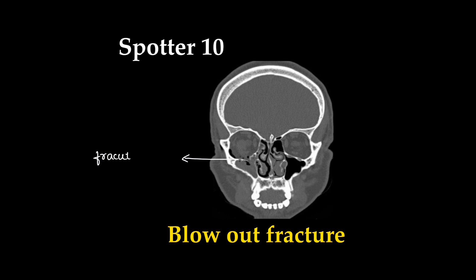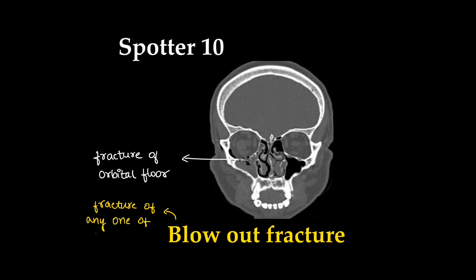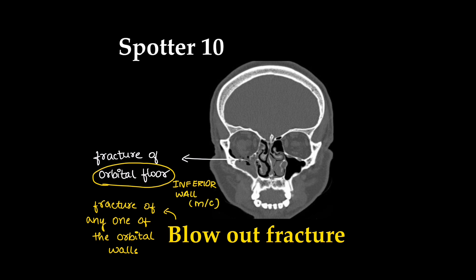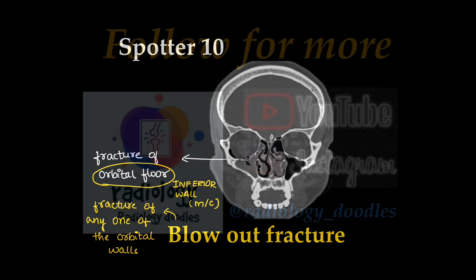In this case we can see fracture of the floor of the orbit, also called a blowout fracture. Fracture of any one of the walls of the orbit is called a blowout fracture, and the inferior wall is the most common fracture seen.